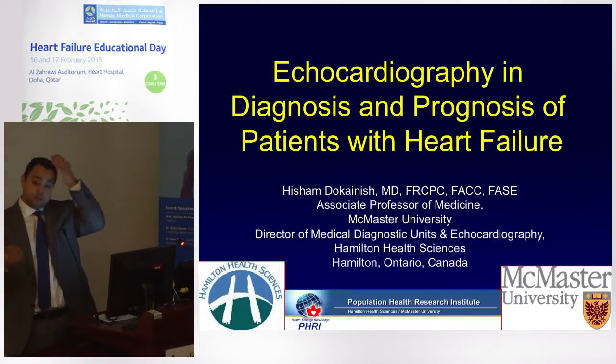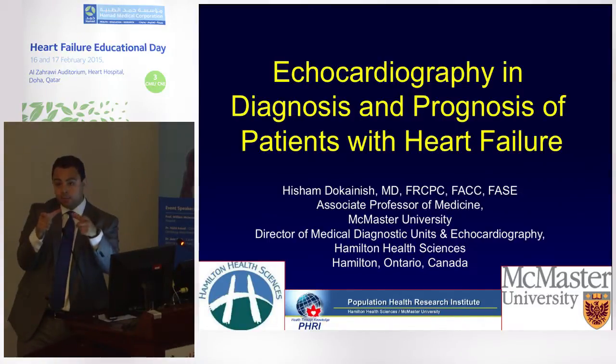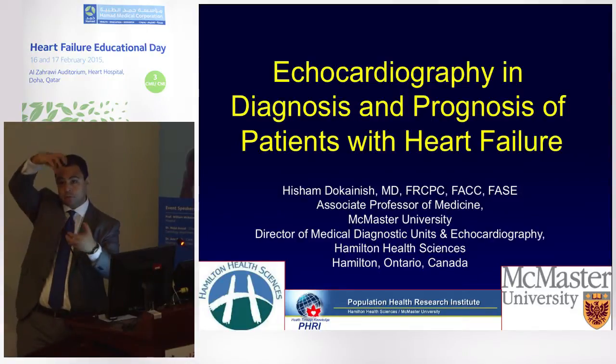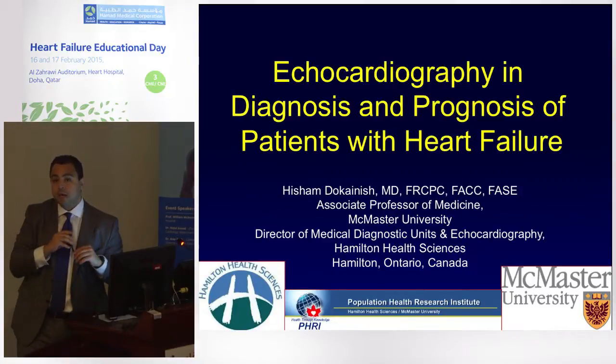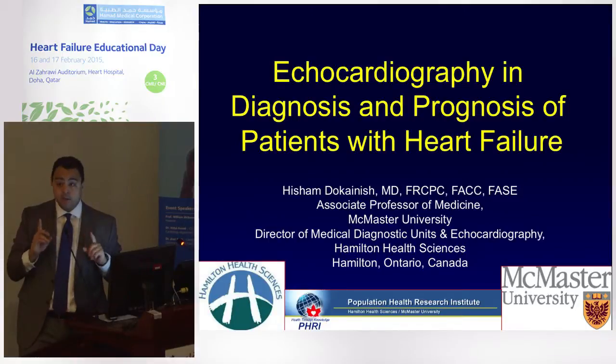Excellent question. I mean, it's not even a question, it's more like a statement, which is a true statement. By convention, we take basal rotation at the level of the mitral annulus and compare it to the true apical rotation. We do not look at it at any other level, but certainly, if there's twist, there's going to be a nadir of twist somewhere in the midsection of the ventricle. But by rotation, we use mitral annular level to true apex, and that can be best discerned on a 3D echo, because true apex can be tricky sometimes in 2D echo if you're off angle. But it's mitral annular to true apex, difference in degrees is twist, and the change in degrees over time is twist rate.